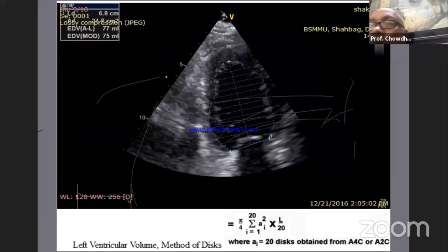The reason why there are mistakes is, if we look at a piece of myocardium, the papillary muscles are horizontal muscles, which are at times confused with the trabeculae.